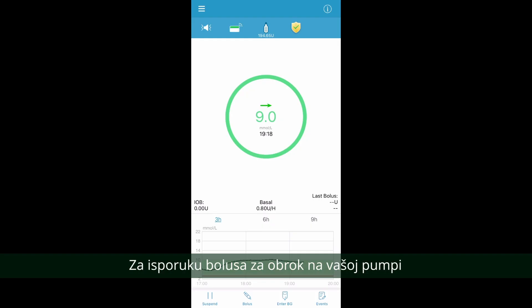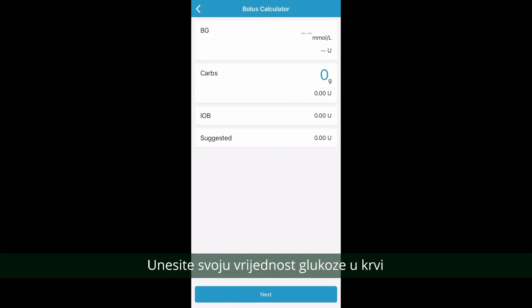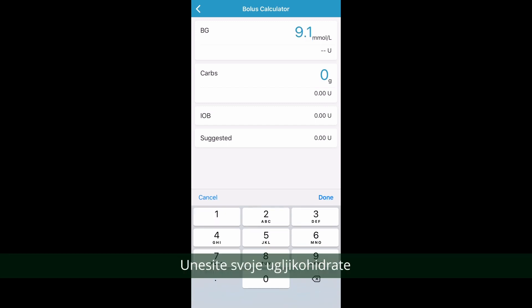To deliver a food bolus on your pump, tap on bolus at the bottom of your smart device. Enter your blood glucose by tapping on the two dashes next to BG. Enter your carbohydrates by tapping on the zero next to carbs.